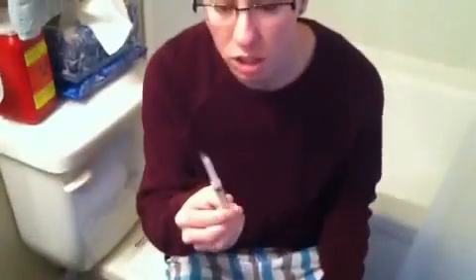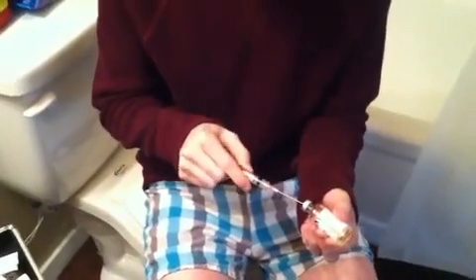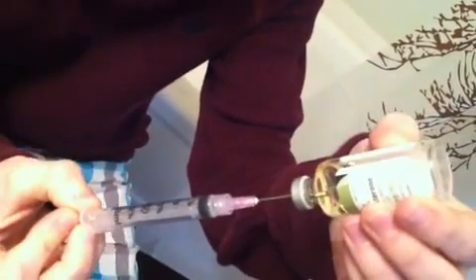Okay, so then you get your syringe. My T is actually really thick. It's like Karo syrup, so I have to draw back with an 18 gauge 1.5 needle, and don't worry, this is not actually going into my leg. This is what I draw back with. You always want to do two needles, one to draw back with and one to actually inject. So this is the one that I would draw back with. You're going to tilt the bottle up, and you're going to start withdrawing.